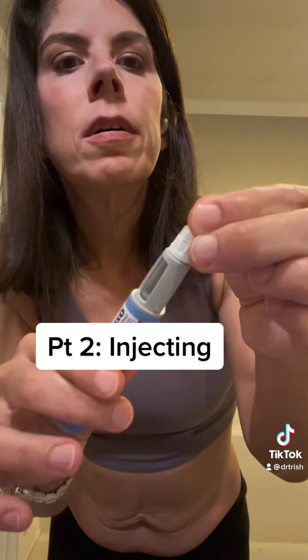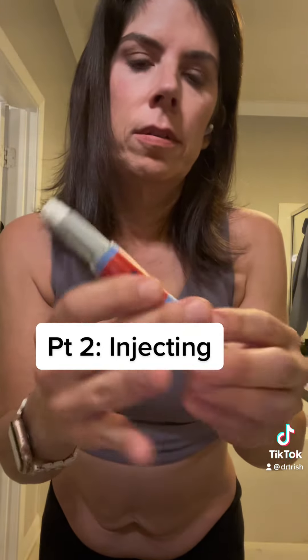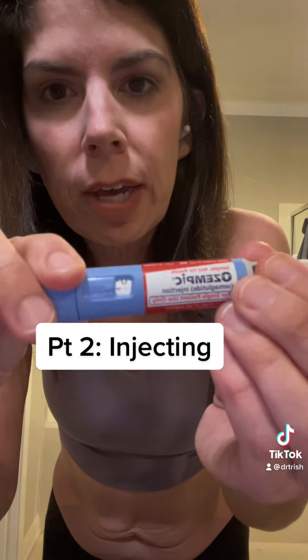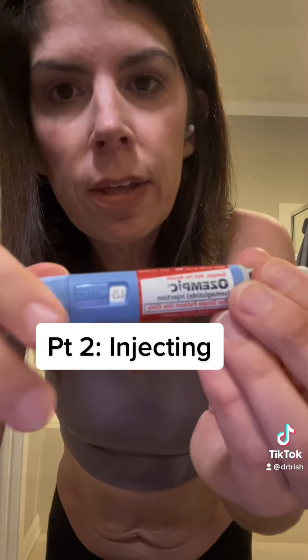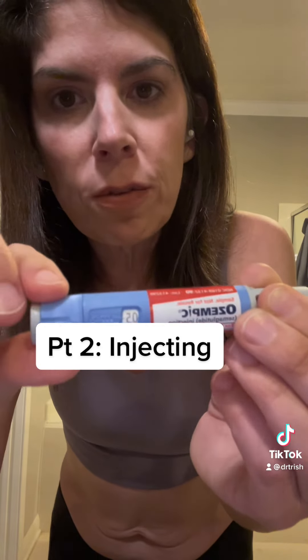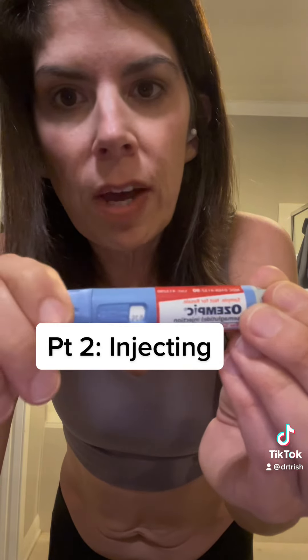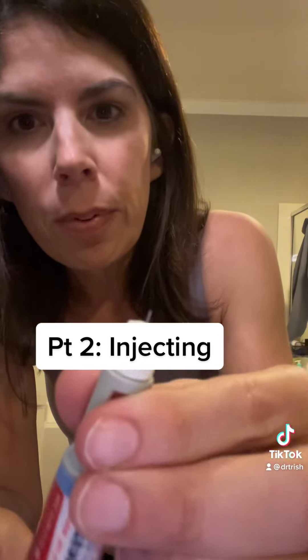For this Ozempic pen, it's similar to an insulin pen where it dials up. The first dose is 0.25mg, and this pen also goes up to 0.5mg. You're usually on the 0.25 for a few weeks, then you go up to 0.5. I just take the 0.25 twice a month for maintenance. Then you dial it up.